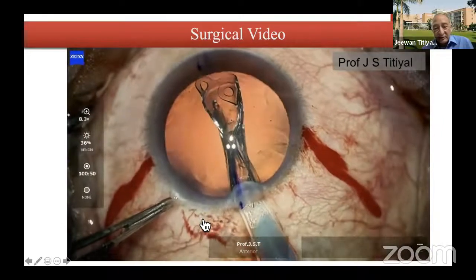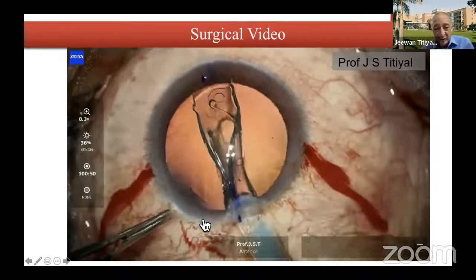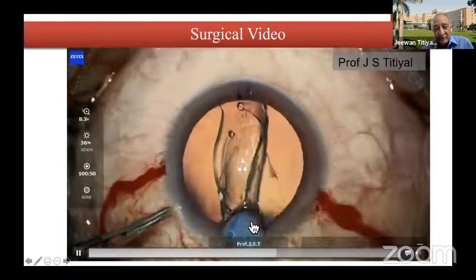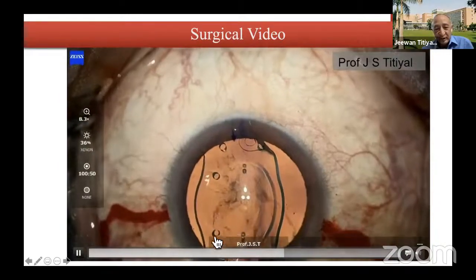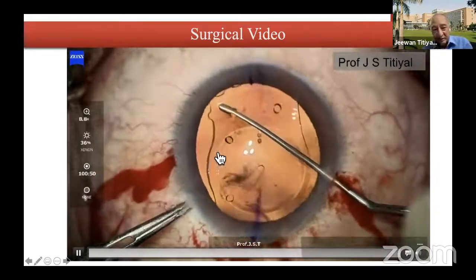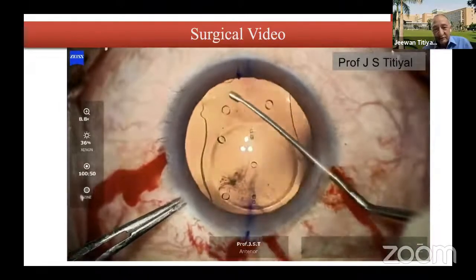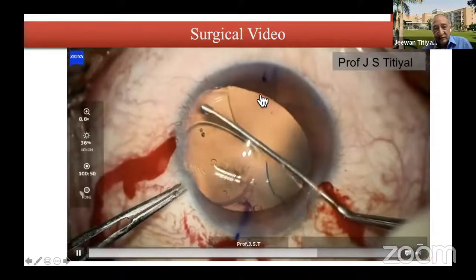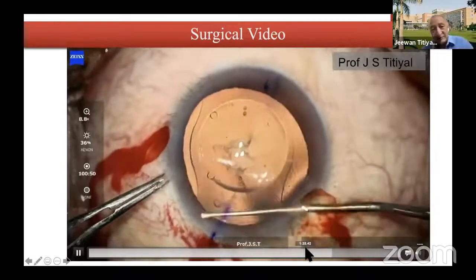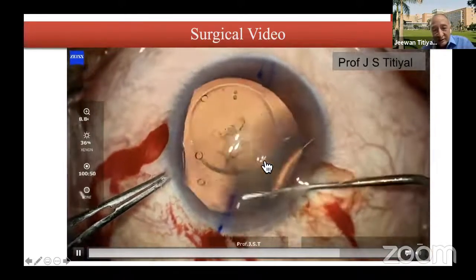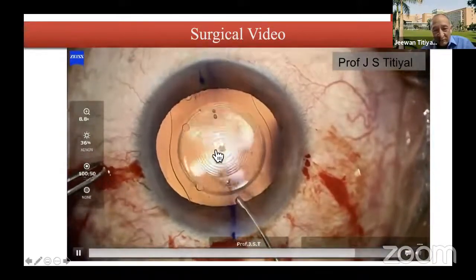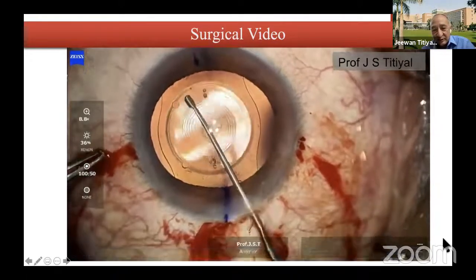You can see how effectively it goes inside the eye without any disturbance. The openings should be towards the upper area — that is towards the 12 o'clock area — there are three openings. Using Healon, the opening is very slow. You can see the rings very effectively. The lens positioning is also very easy with a three-point fixation. Viscoelastics should be removed after you orient the lens in the proper axis. Once you remove the viscoelastic, subsequent manipulation should not be done — orient the lens to the desired axis first, then remove the viscoelastic effectively.